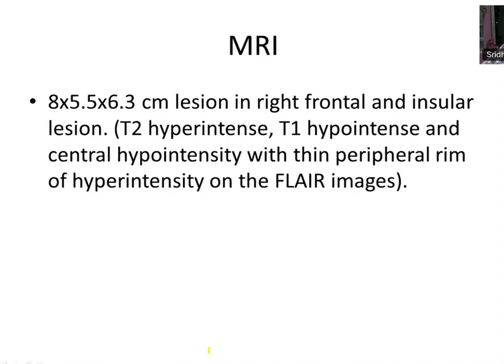We'll skip that, as Abhishek will give a summary at the end of it, two cases. So again, a right frontoinsular lesion, similarly, which has some features suggestive of necrosis as well. This is the morphology. Can you describe it?